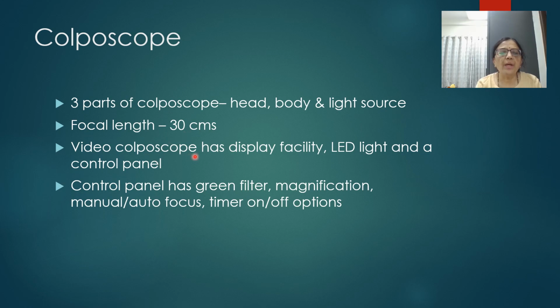Video colposcope has a display facility. It is very good, and whenever I have done colposcopy in my career, I have done it with the video colposcope. It has a good display facility so that you don't have to look through the eyepiece with your eyes. You get an image and you can see the display, and more than one person at a time can also see the display.